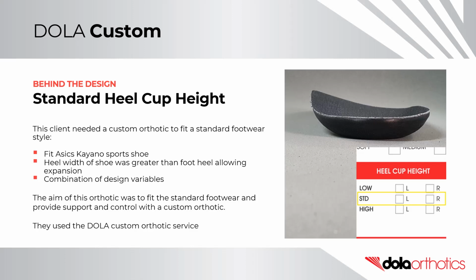It also allowed for a prescription of a combination of design variables. The aim of this orthotic was to fit the standard footwear and provide support and control with a custom orthotic. They used the DOLA Custom Orthotic service.